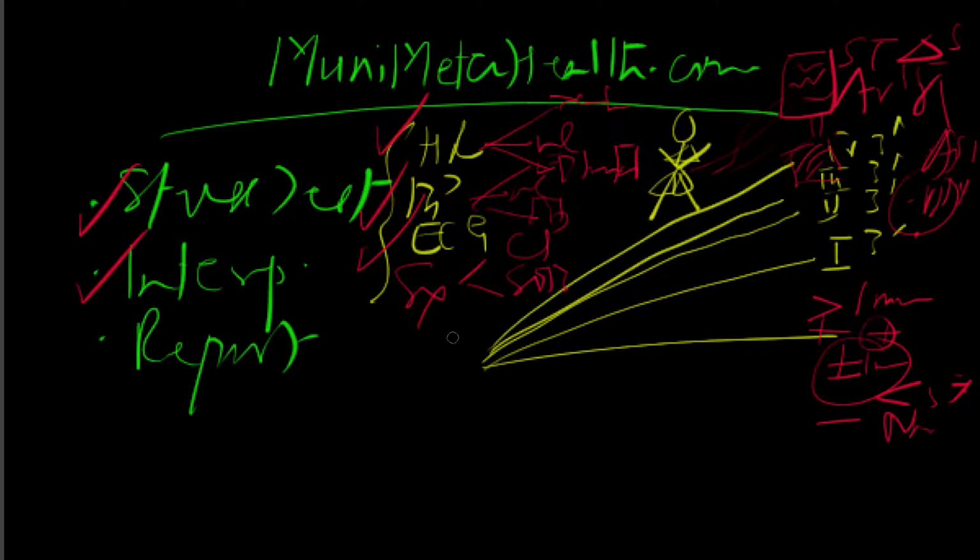So I think it's very, very important that we understand that we should try to hedge towards saying either a negative test or a positive test, depending upon what you see on the ST segment changes, what you see on the heart rate response, what you see in the blood pressure response, and then of course the symptoms correlation is very, very important. Now, how do you write a report?